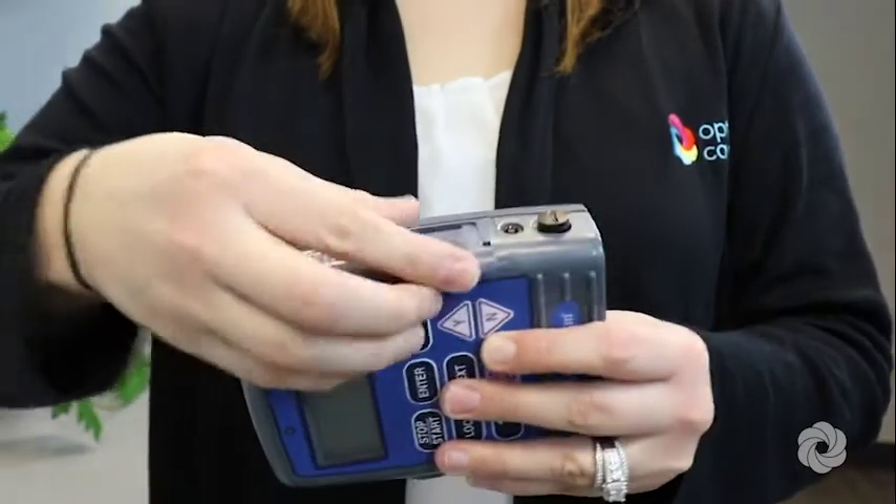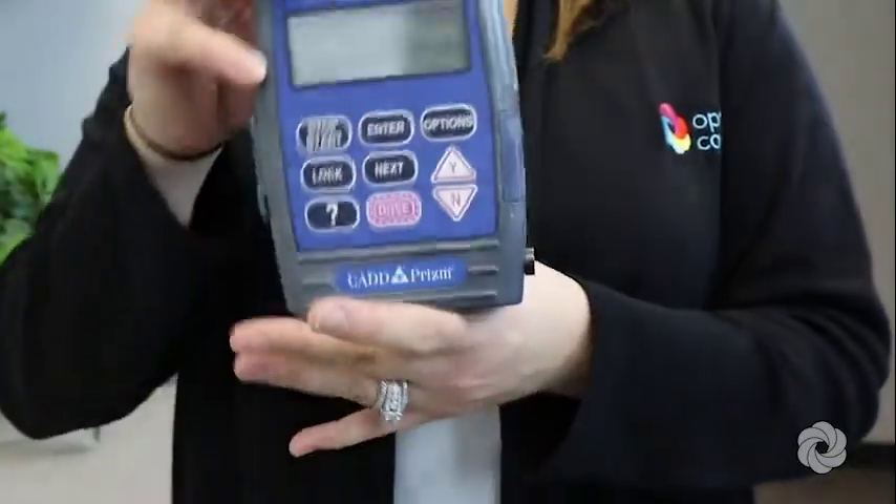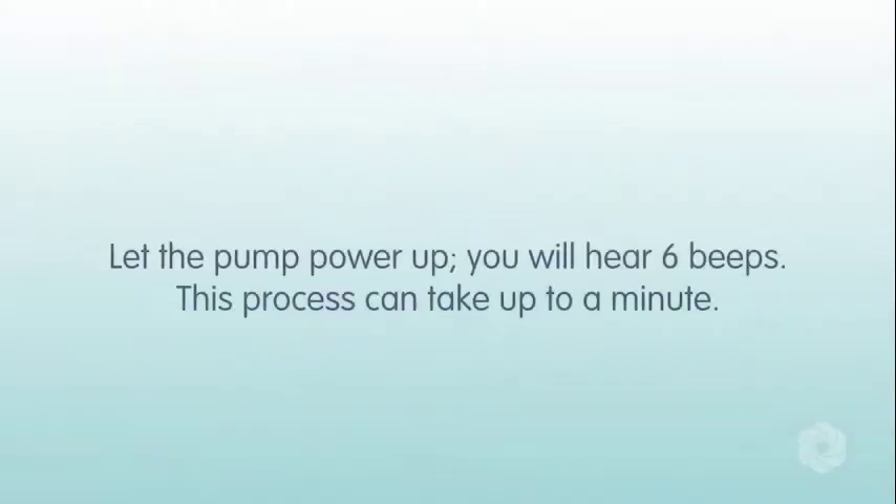Slide the battery door back on and let the pump power up. You will hear six beeps. This process can take up to a minute.